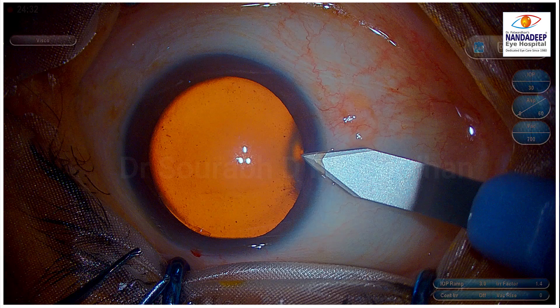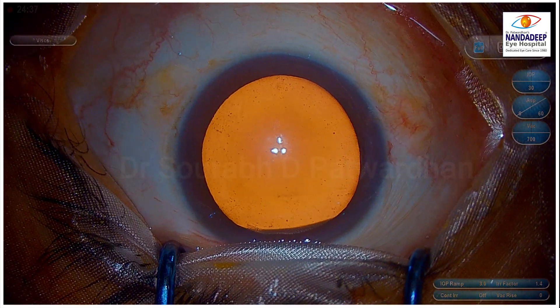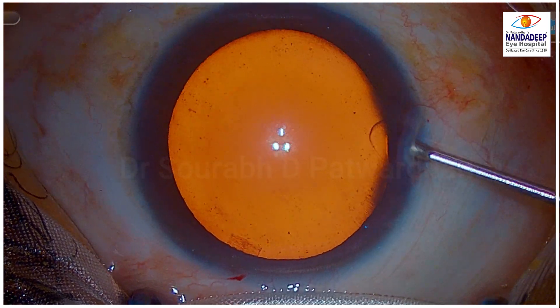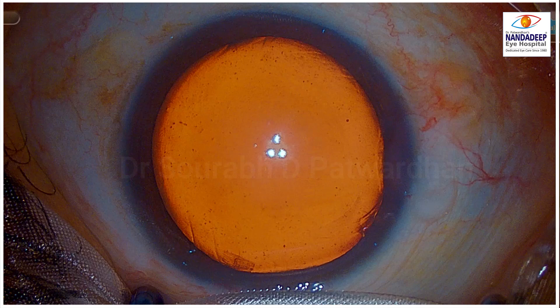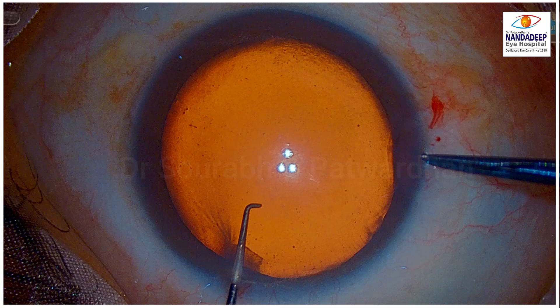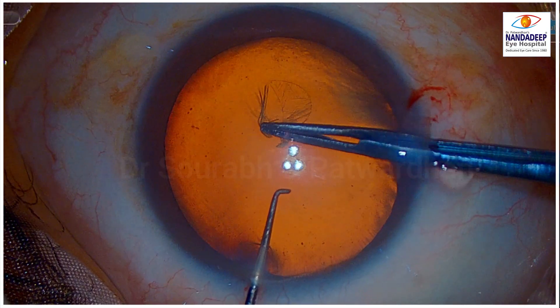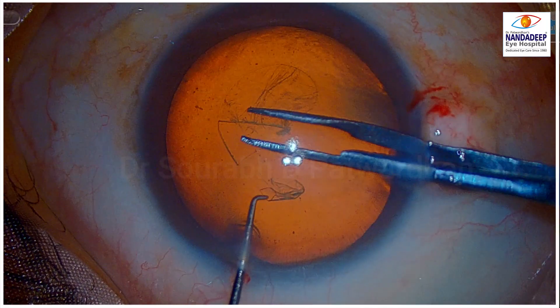In these cases, there are a few prerequisites. You have to get a good hydro dissection, and before that you should have an adequate size capsulorhexis. Many surgeons at the beginning of their career have difficulties with this, so they tend to make very small capsulorhexis. If the capsulorhexis is small, this technique can still be done, but it's always easy if you have a 5 millimeter capsulorhexis.